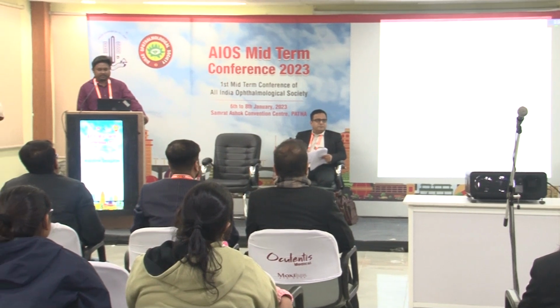Morning, my paper is about the intravitreal Ozurdex and the intraocular pressure changes after implantation. We have no financial disclosure with regards to the study.